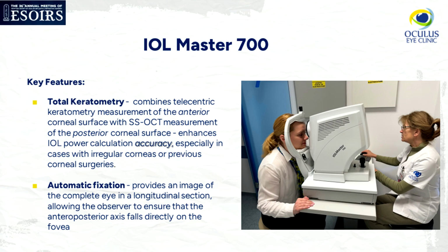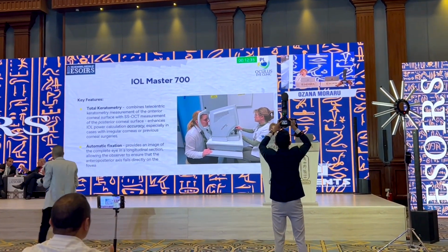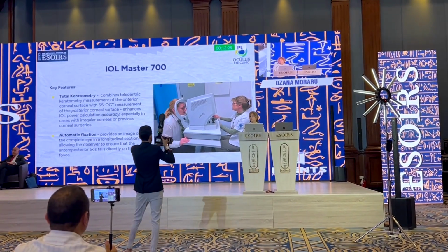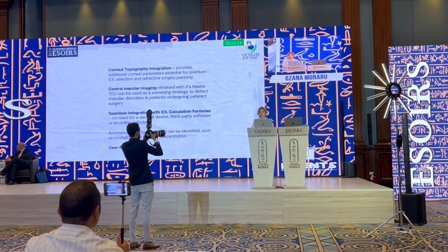Regarding the IOL Master 700, there are some key features. It measures the total keratometry, combining telecentric keratometry measurement of the anterior corneal surface with the measurement of the posterior corneal surface, thus enhancing the IOL power calculation accuracy. It has automatic fixation, providing an image of the complete eye in a longitudinal section, along with the doctor, the observer, to ensure that the anteroposterior axis falls directly on the fovea, so for more precision and more accuracy.